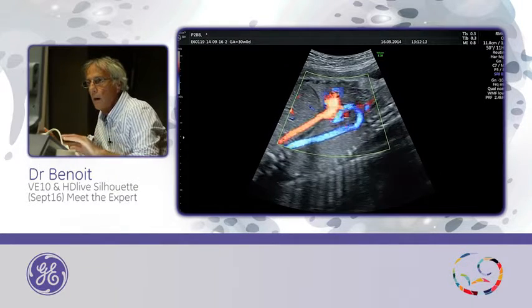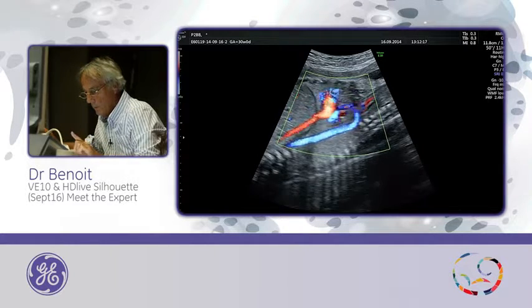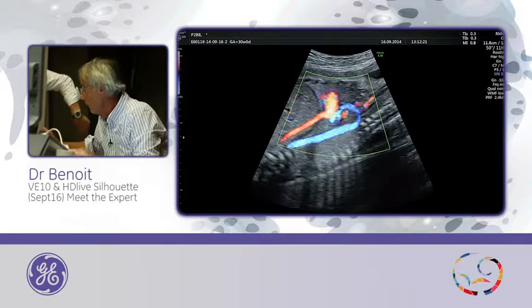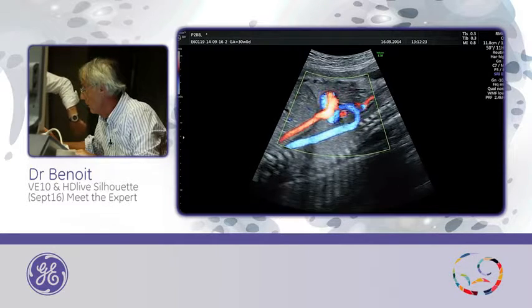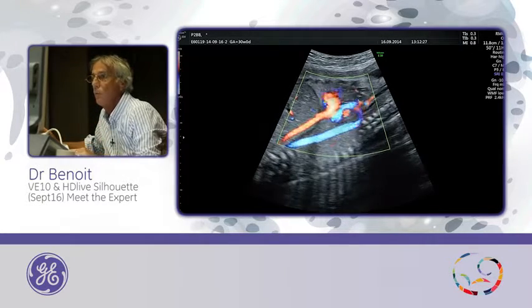Okay, I will do it with a static. I have 17 minutes. Until? It's now 1:15, so until 1:30. It's finished at 1:30. Okay, so I do this and we'll open some case.